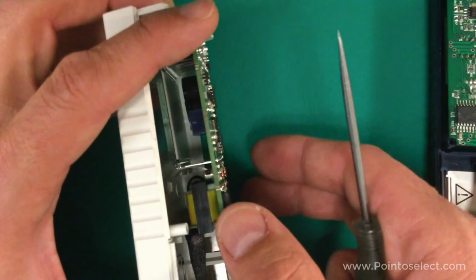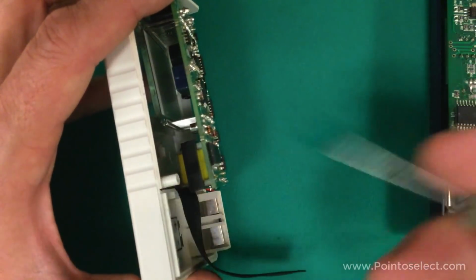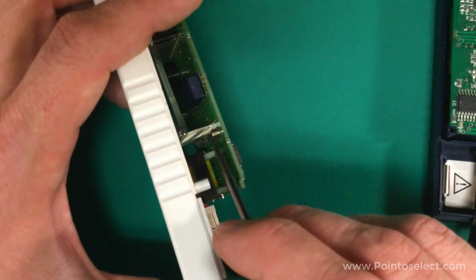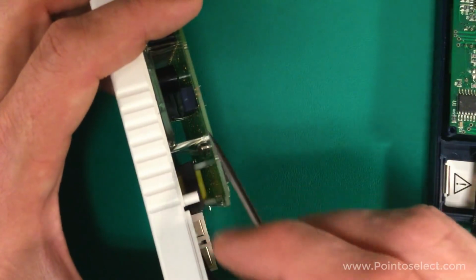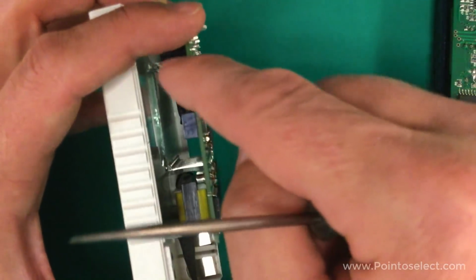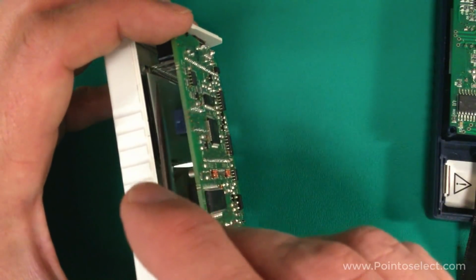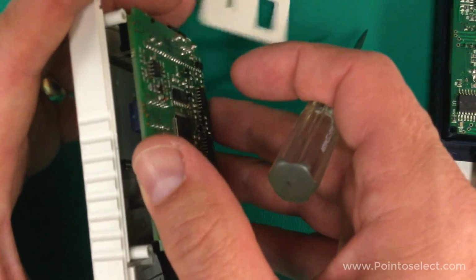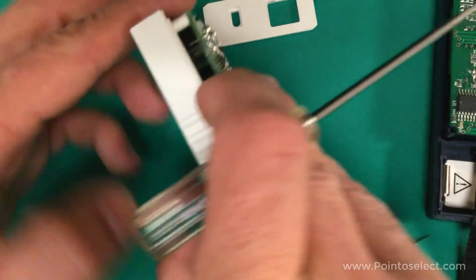Okay, so this big yellow unit, that's a large transformer. That gives you the high voltage output. There's the crystal for running the microcontroller. That's going to be a relay. That's probably the relay that turns the treatment on and off. And then this is the display here. You can see the edge of it. It's got these long legs so that it stands up from the circuit board, so that when the circuit board sits down in, whoops, then you got it where it belongs.